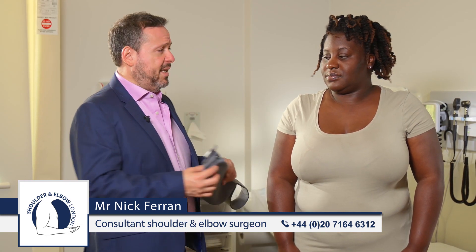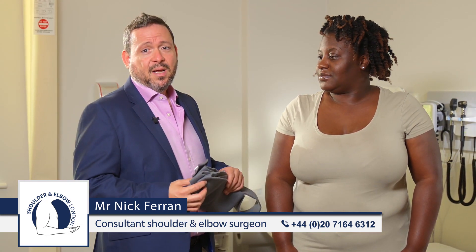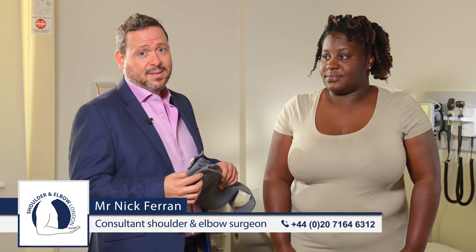Several patients after shoulder surgery will need to be in a sling, and today my patient Michelle is going to help us demonstrate how you put these shoulder slings on, as they can be complicated sometimes.